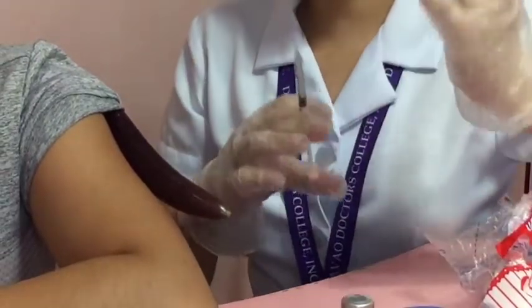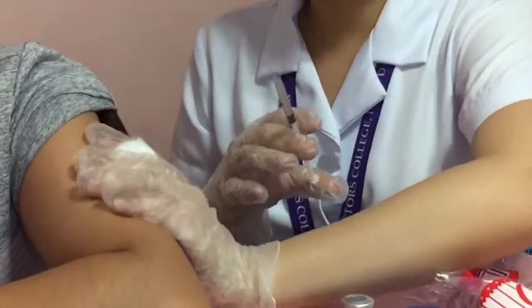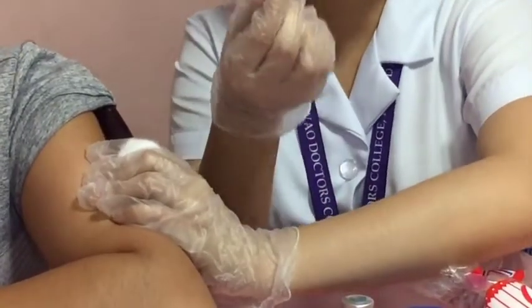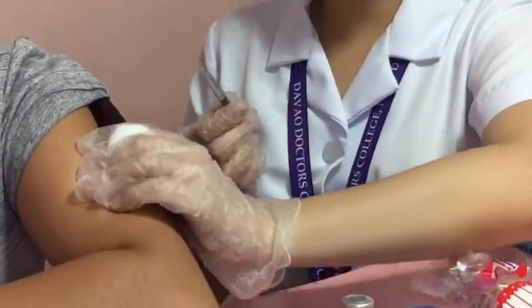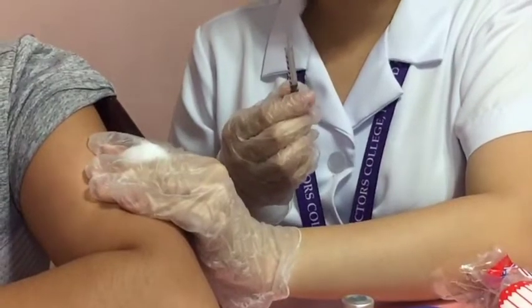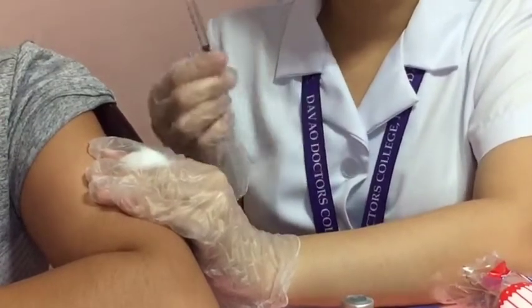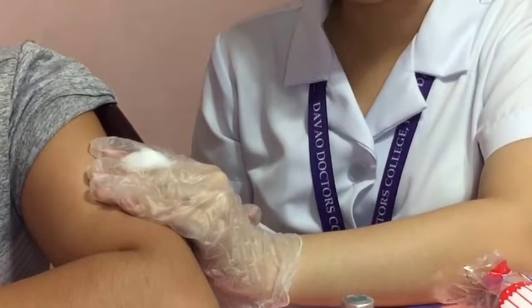Then now, let's proceed injecting the medication. Grasp the syringe with your dominant hand by holding it with your thumb and fingers, with palm facing sideways or upward, at about 45 degrees. Now, using our non-dominant hand, let's pinch or spread the skin of the site and insert the needle using the dominant hand in a firm, steady push. Sure ako ma'am ha.